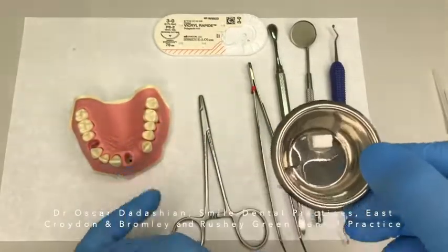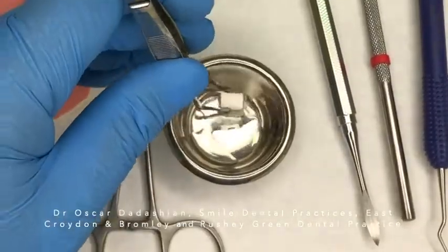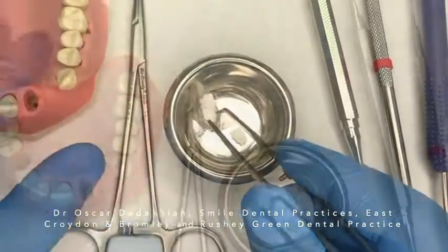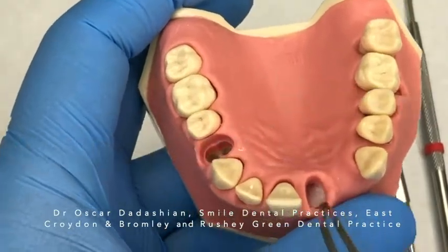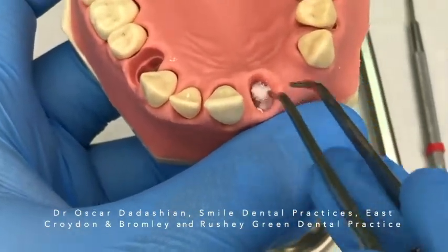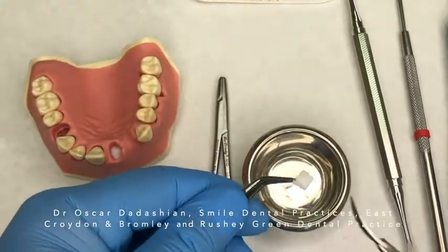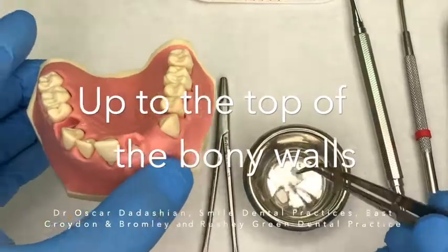It makes sense to place the Bio-Oss Collagen as a block inside the socket, but it's not always that easy. So I tend to cut it into smaller pieces and put it in the socket as those smaller pieces. I start gently placing the pieces without crushing the Bio-Oss particles, putting them in one by one. If the last piece is extruding out of the socket, take it out, trim it, and put it back in. Do not press or crush it into the socket.